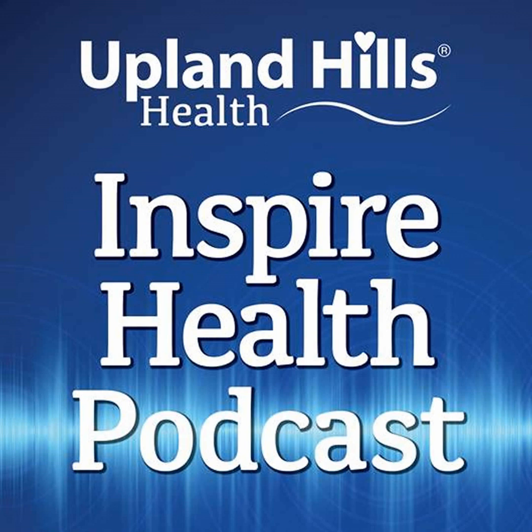Medication can do that too. If you've been at a certain pressure for years and your weight has increased, that can cause the snoring. So it's important to look at the whys of why might I be snoring when I wasn't before. That's important to talk to your sleep provider about as well.